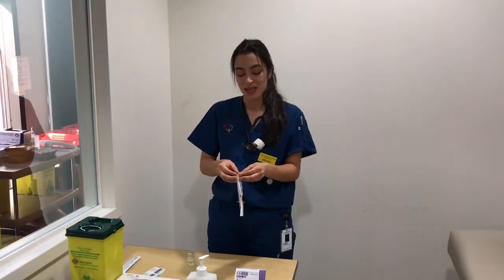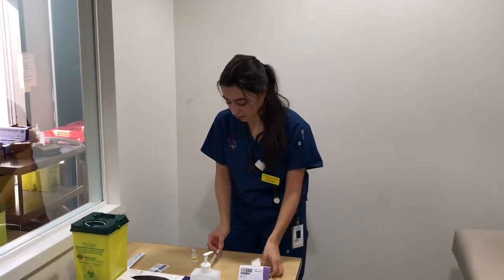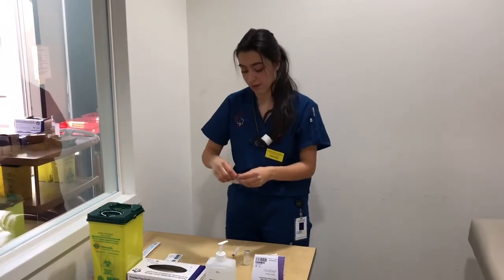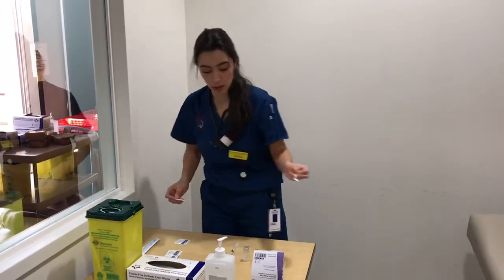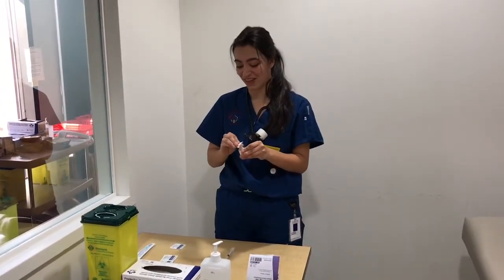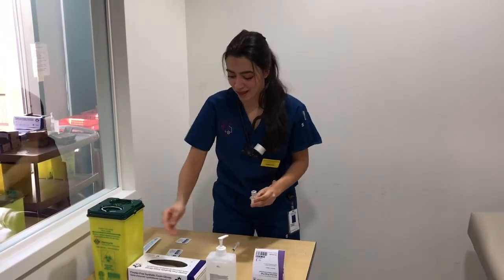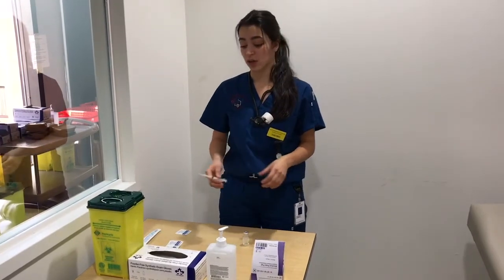I don't think that the injection pad or the dummy is going to mind. So next what you're going to do is open up the needle, and sterilize the top of the vial that you're going to be using, and discard all the garbage in a garbage bin that should be close to you. It's important to have everything that you need very close to you just to minimize any type of errors that could happen.